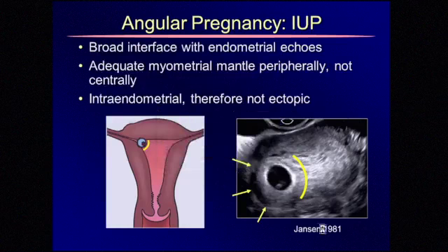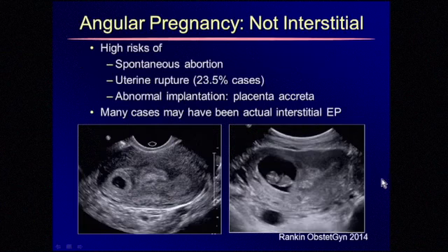Now, it's been in the literature since 1981. However, we dropped this term because we were not good at seeing these with our older equipment. It is more recently now that the term has come up in the literature because we have these high resolution transvaginal probes and 3D ultrasound.